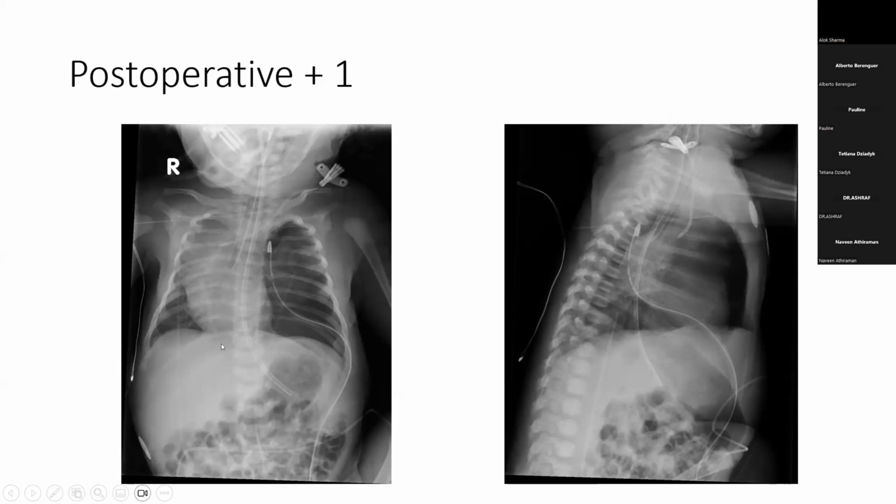The patient was quite stable for his ventilation, but it was difficult to see. We see midline shift, and we were wondering, is it a pneumothorax? Is it pneumomediastinal air? We were just wondering, so what is it?